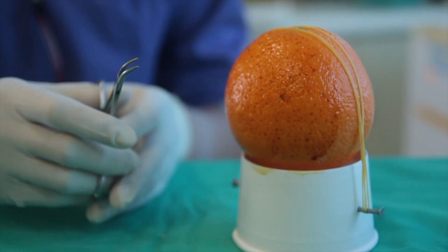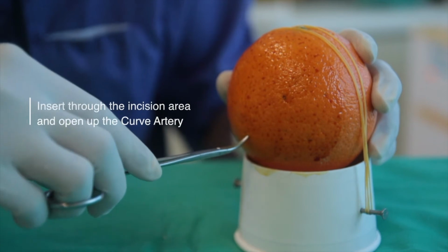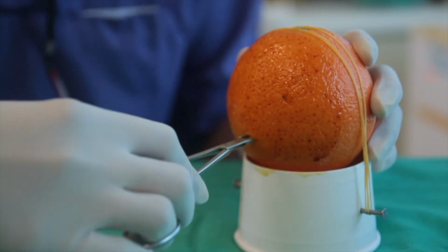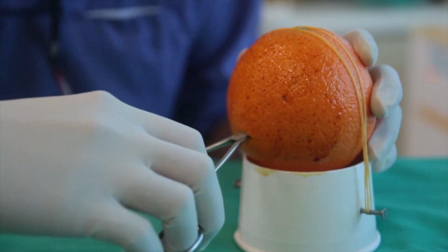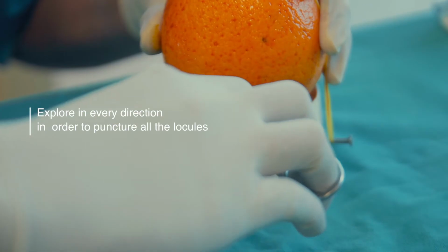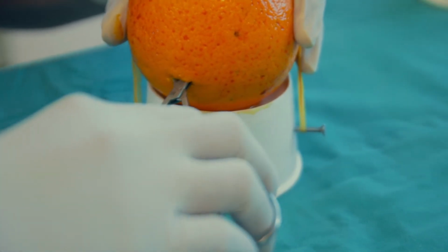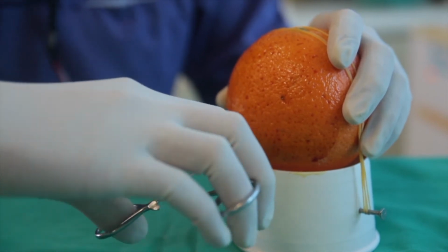And then by using the curved artery, insert it into the incision that you have made just now and try to puncture the abscess area, going in and open up the curved artery. Go in every direction to make sure you puncture all the locules. As you notice, there is already some fluid coming out.